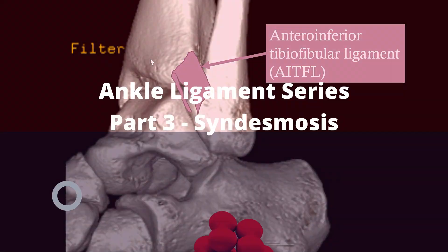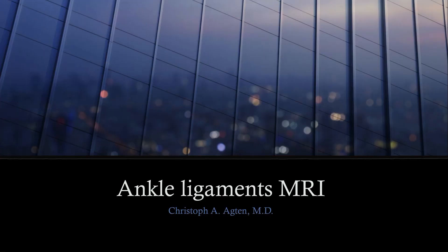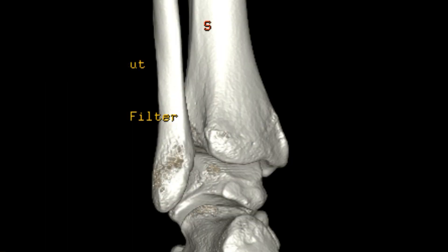In this video, part 3 of the ankle ligaments, we focus on the syndesmosis. The injury of the syndesmosis of the ankle joint is an important injury. It's commonly known as a high ankle sprain, as opposed to a normal ankle sprain, and it's important because these injuries of the distal tibiofibular joint have longer recovery times and longer return times back to play for athletes. So always give the syndesmosis a good look in every MRI you have in front of you.